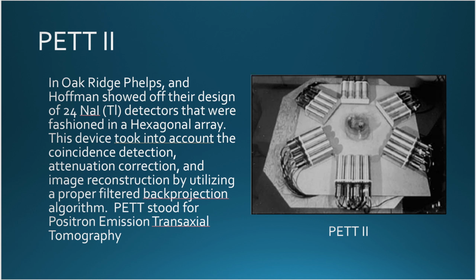PET-2. In Oak Ridge, Phelps and Hoffman showed off their design of the 24 NaI-Tl detectors that were fashioned in a hexagonal array. This device took into account coincidence detection, attenuation correction, and image reconstruction by utilizing a proper filtered back projection algorithm.